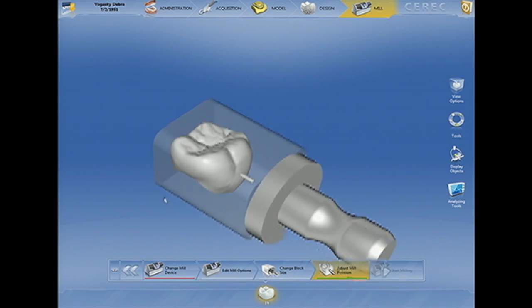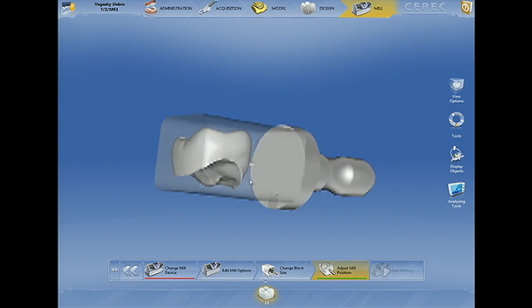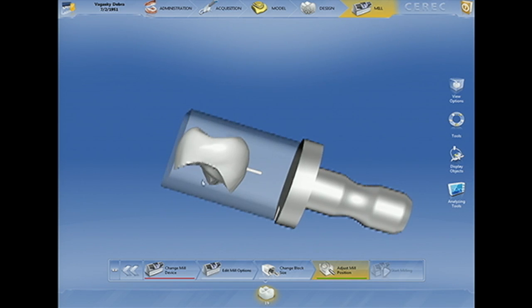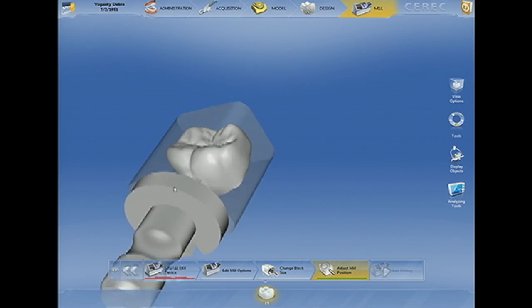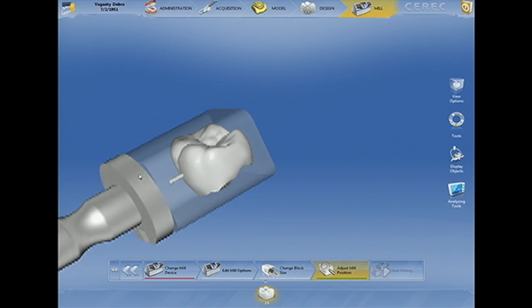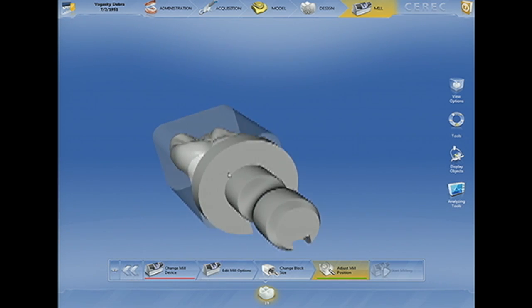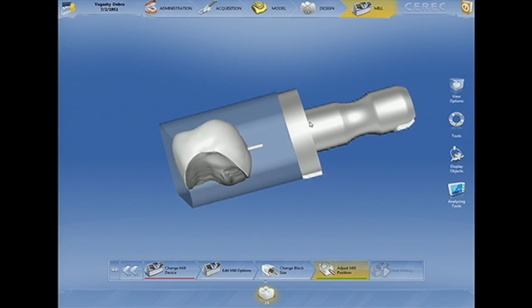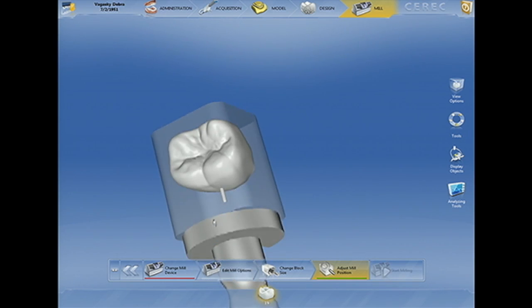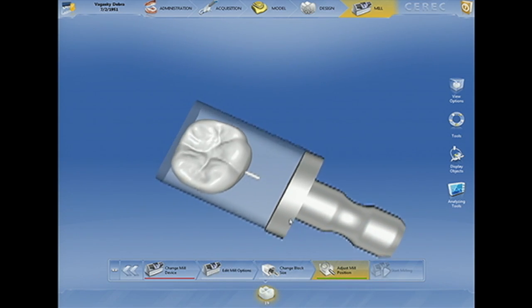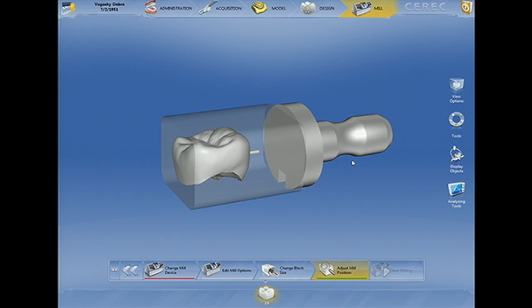Because we're making a CEREC guide, I haven't taken a Galileo scan at the moment. You can certainly, in your practice, take a diagnostic scan just to evaluate and assess the anatomy to see if the patient is a candidate for an implant. But I try to kill two birds with one stone, so we haven't yet taken that Galileo scan. In order to make a CEREC guide, I have to generate a scanning appliance.